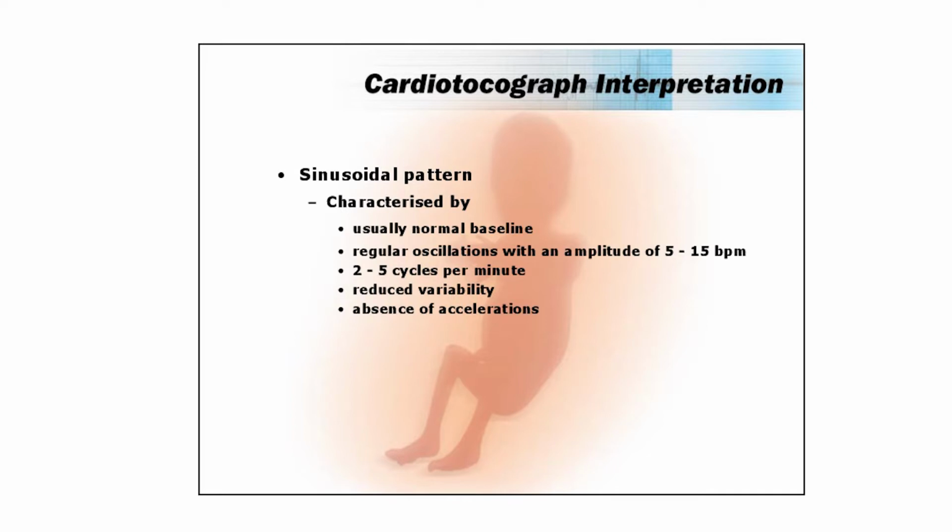Yeah? So in my experience, people say, Declan, I think I might have a sinusoidal tracing here. Could you have a look? And we may conclude it's not. That's much better than saying, I think I have a sinusoidal tracing, I'm not sure, and I'm not going to do anything about it. So it's characterized by regular oscillations in the fetal heart. I'll show you here in a second.